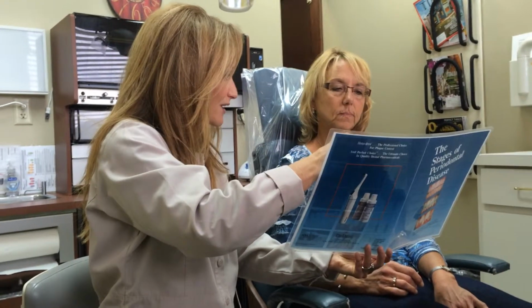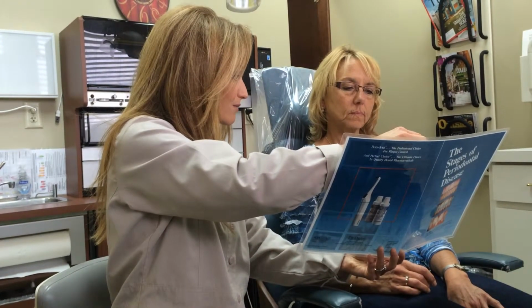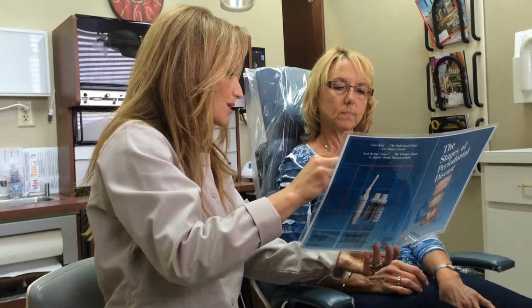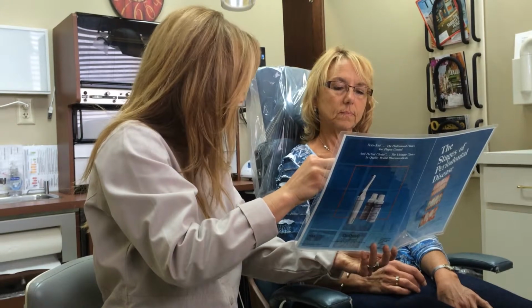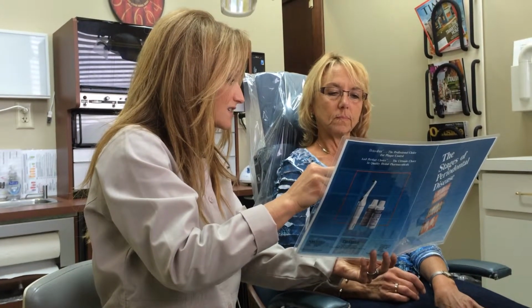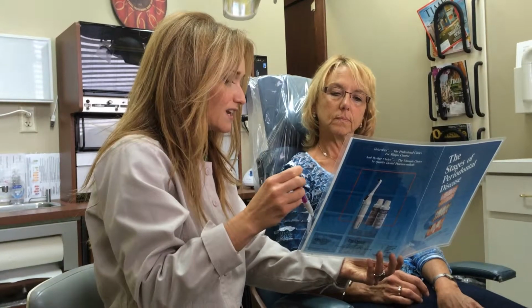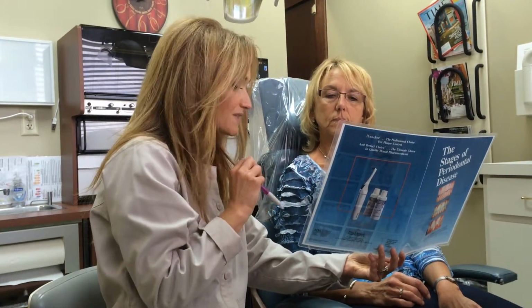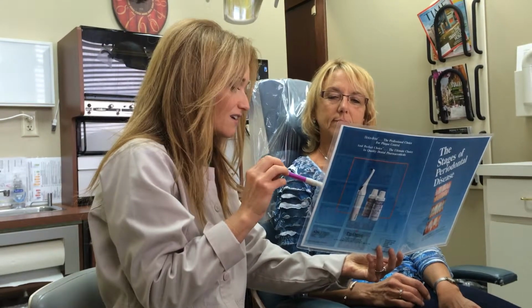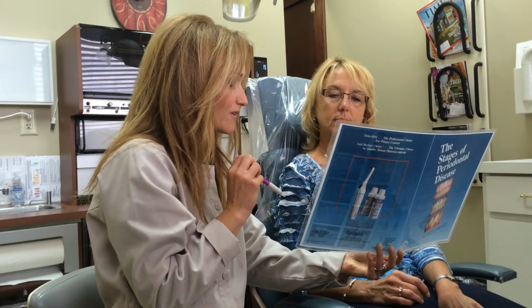As we advance into periodontal disease, our numbers are going to be between 3 to 4 millimeters, so we'll drop down farther with our ruler. Now this infection is not only in the tissue causing bleeding, but it's started to deteriorate the bone. When we touch the tissue, we'll get bleeding. If you look closely at that bone, it looks like a little mouse or something ate away at the bone. It's very jagged. That's actually what the bacteria is doing. It's deteriorating the bone in there.